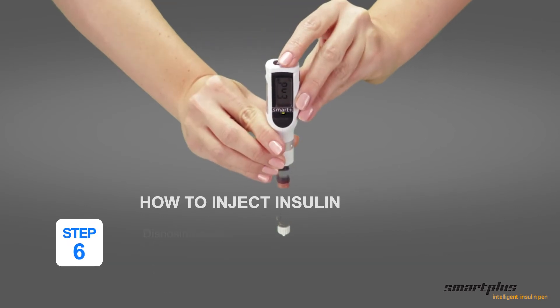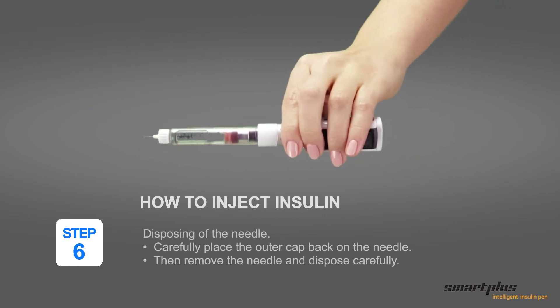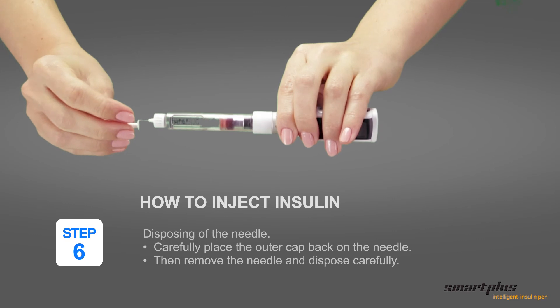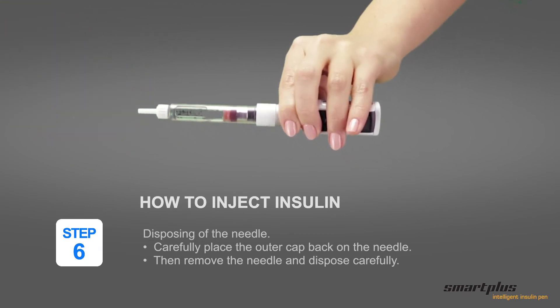The pen now displays end. Step 6: Disposing of the needle. Carefully place the outer cap back on the needle. Then remove the needle and dispose of it carefully. Thank you.